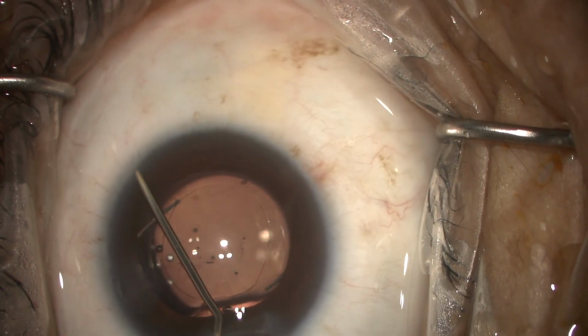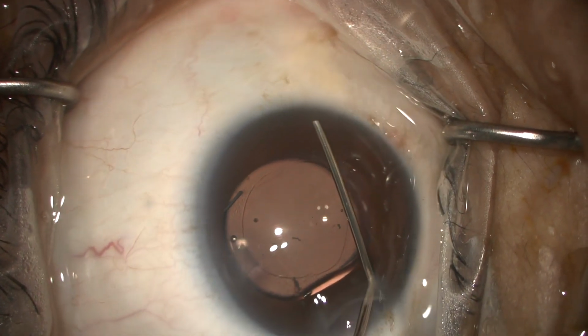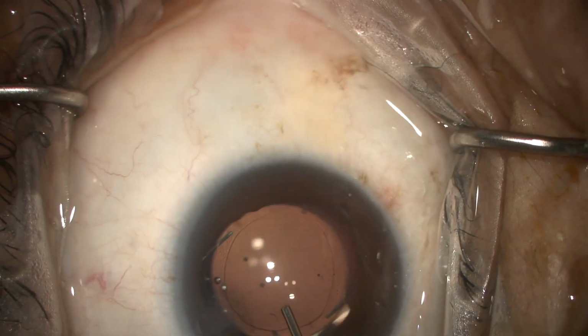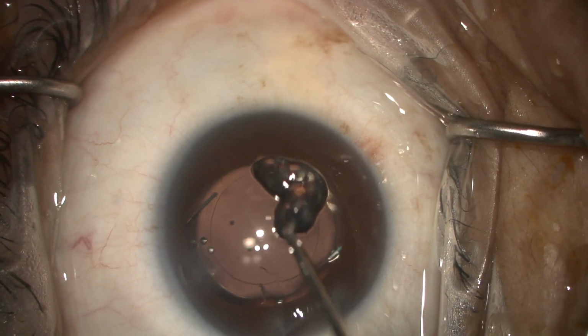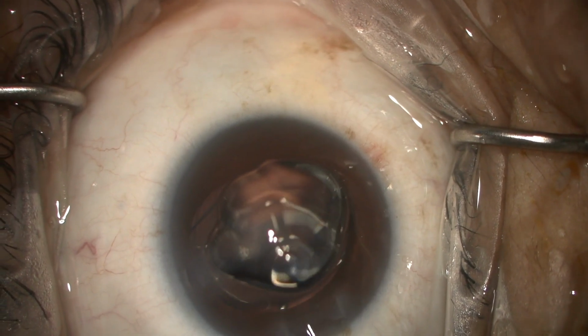The procedure itself is very, very similar. You see me sort of bathing the angle with some viscoelastic. I like to brush the iris down a little bit too. And you see me putting some viscoelastic on the surface of the cornea.